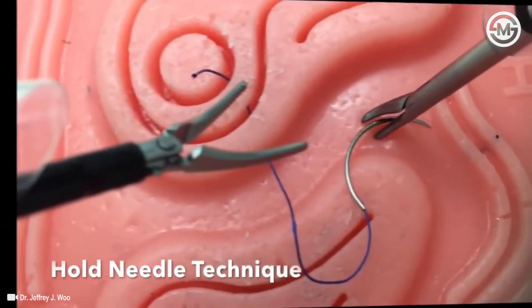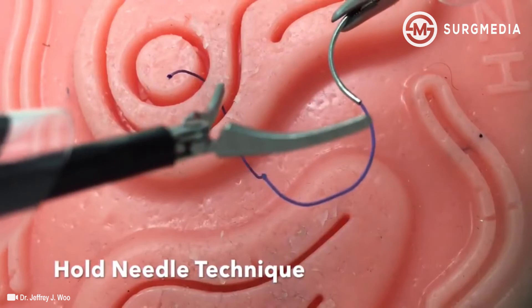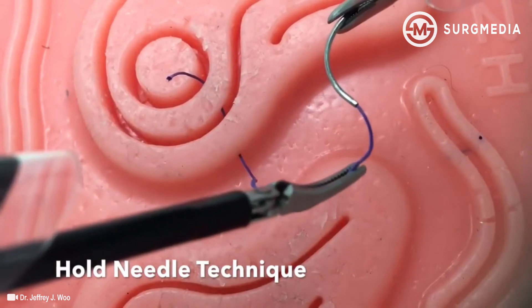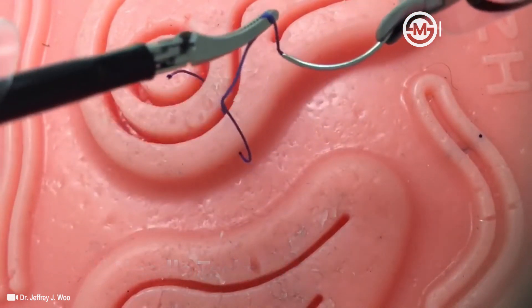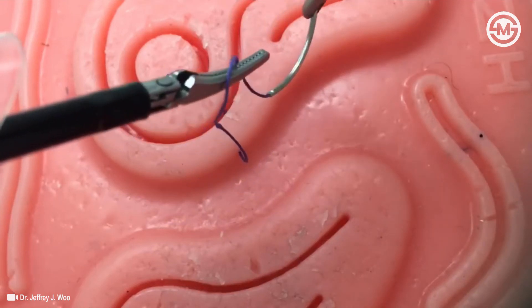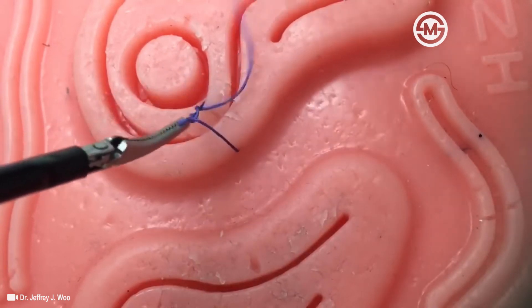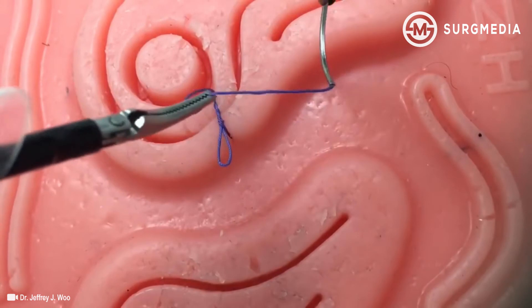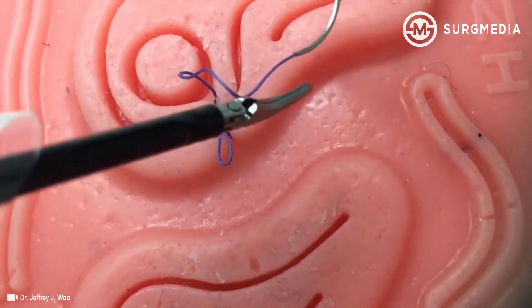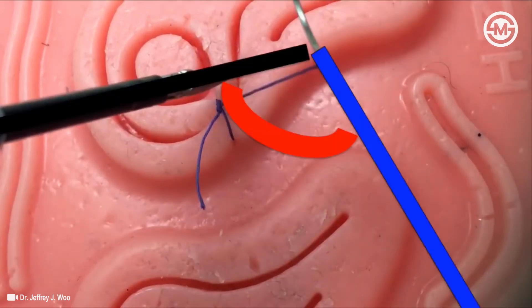The next technique is the hold needle technique. This technique may be beneficial with shorter sutures. In contrast to the drop needle technique, here the needle is constantly held. The key principle is to rotate the needle to line with the suture and to again minimize the instrument to suture angle. By creating this almost parallel angle and utilizing the sturdiness of the needle, wrapping your suture around your left instrument becomes virtually effortless. Remember to alternate your throws by placing your left instrument on opposite sides of the suture, and always rotate the needle to line up with the suture to minimize the instrument to suture angle.